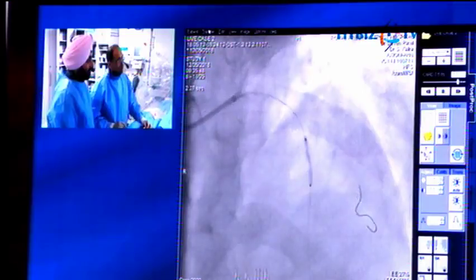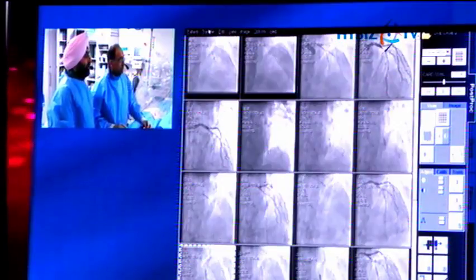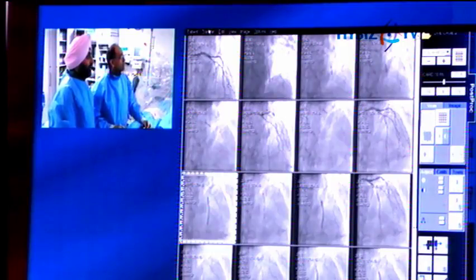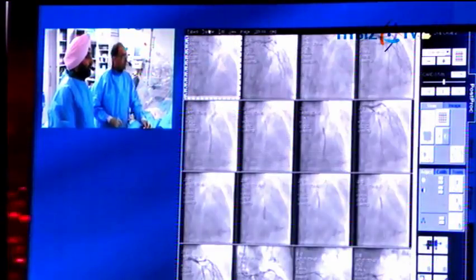Now go fast forward to the page view, please. Just page view now, thank you. Go further down, post-dilatation, keep going further down. Go back a bit, run number 13, if you can go. Up and up. Further up, that's it. Before that. Yeah, and after. Next shot, next shot.